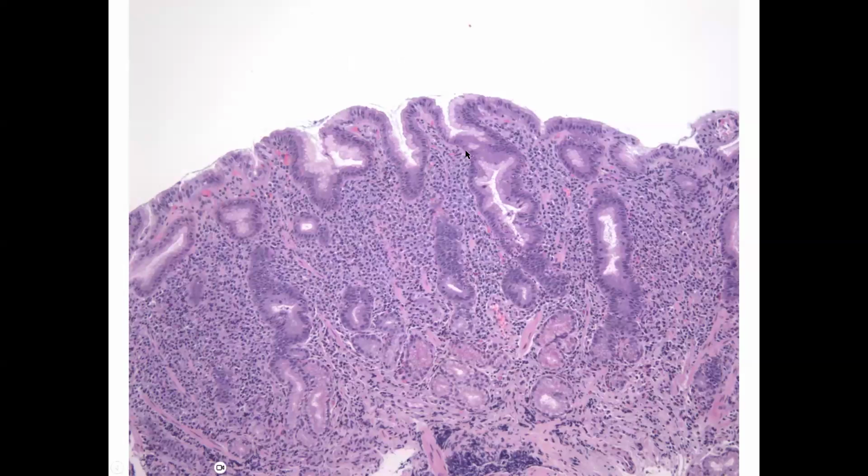So in this example, a similar magnification shows, wow, all of these glands are no longer back to back. There's quite a bit of space between them. And instead of being clear in between the glands, there's a high degree of cellularity. There's basically a lot of blue cells in between all of these glands. So we have an increased, expanded lamina propria with a lot of blue cells pushing apart the glands here. And so we want to go ahead and take a look at that on higher power.